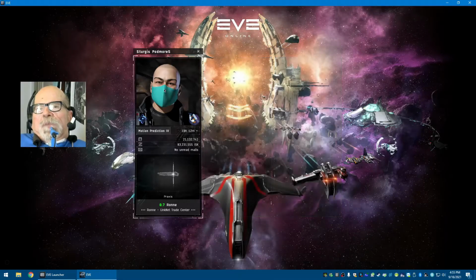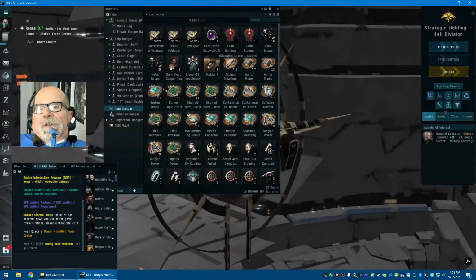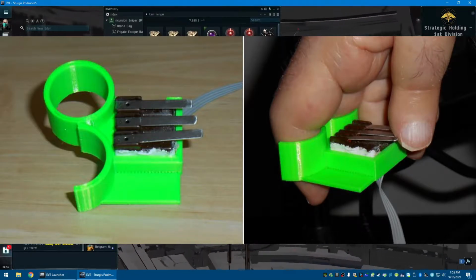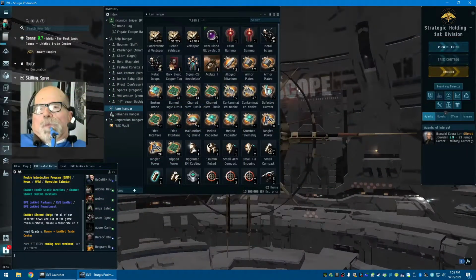Connecting. Now I have 3 push buttons in my right hand that are connected to a small 3D printed ring that I call my sling ring, after the device that Dr. Strange uses. And my friend Johnson came up with that name. I was pretty mad because I didn't think of it first, but that's neither here nor there.